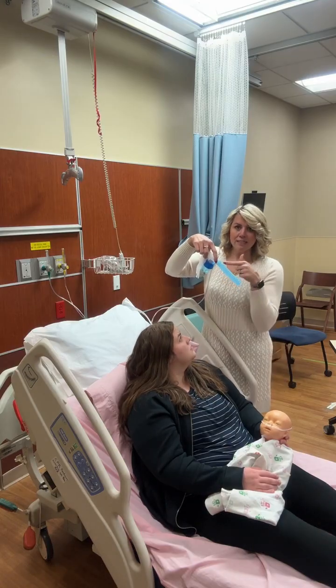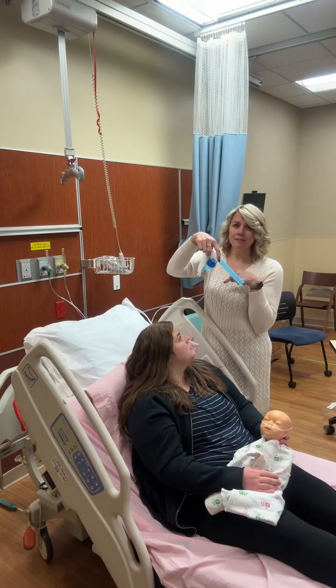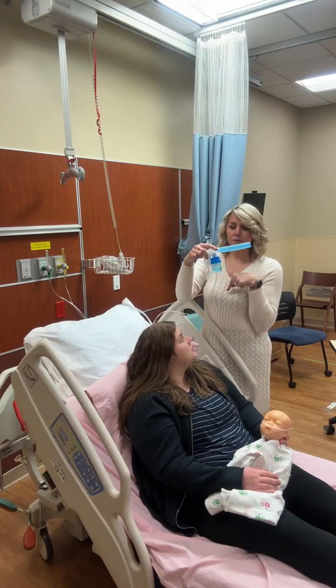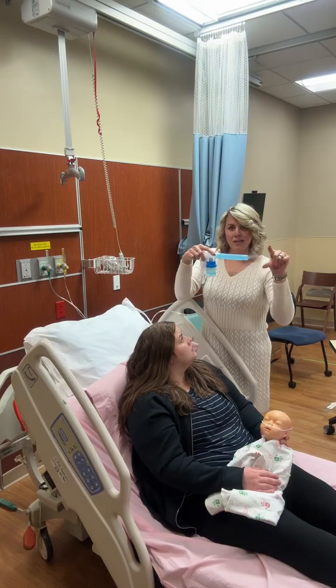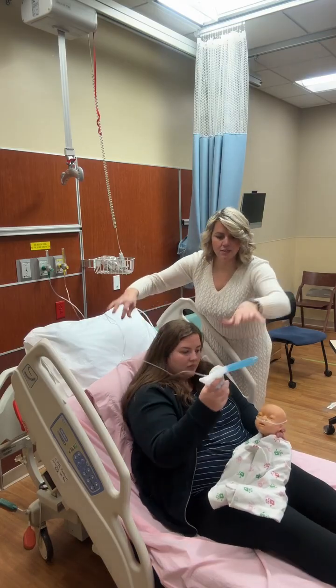Now Mom, if I go like this, then you'll hear that sound. It stops, which means the medication is not nebulizing. So we have to have it upright so that the medication will come out. So Mom, I need you to hold this in front of your baby's face.